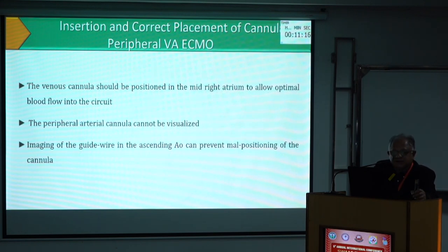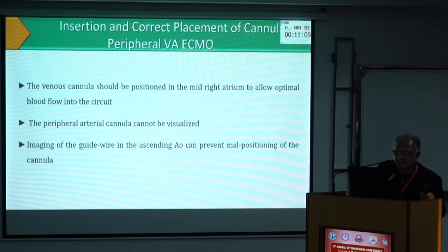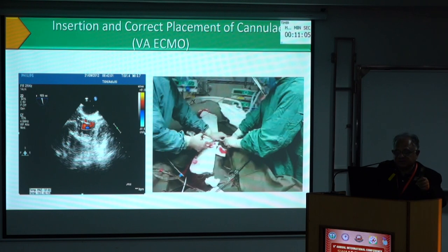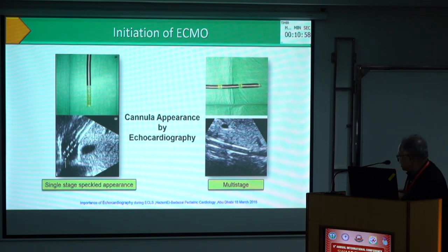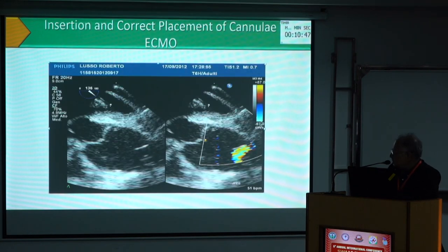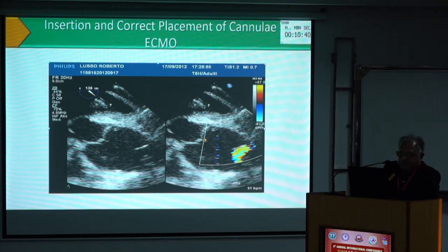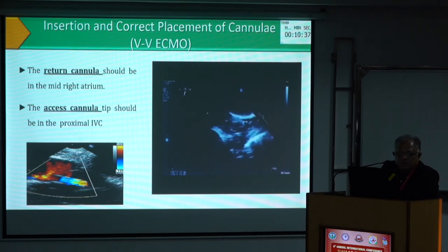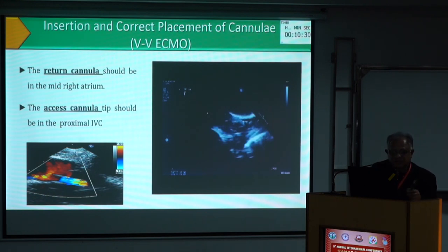Venous cannula is normally in the mid-right atrium for optimal blood flow. Peripheral arterial cannula cannot be visualized directly, but you can see the guidewire as it goes through the ascending aorta. You can see the single-stage cannula tip and the multi-stage cannula. Here is the liver and you can see the aorta. You can put a Doppler on the aortic valve to see the cannula going in and confirm flow. For VV ECMO, the return cannula should be in the mid-right atrium and the access cannula in the proximal IVC, and a Doppler will detect flow there.